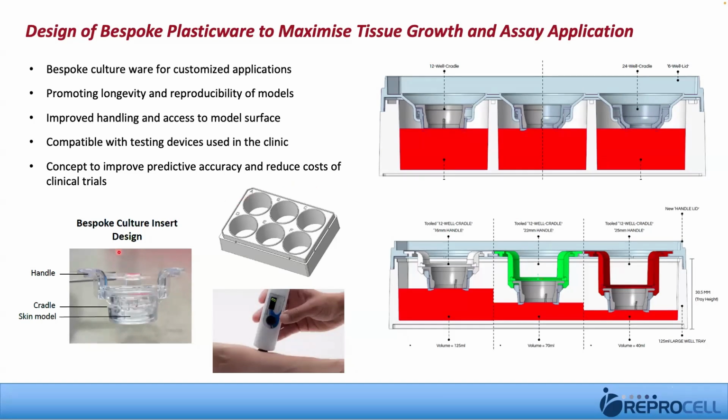And we've also designed our inserts to be compatible with some instrumentation which is used in the clinic. So this is a device here in this photograph, which is used to measure water loss from the surface of skin. And that device can also fit into our inserts very comfortably and operate as it would on real skin.